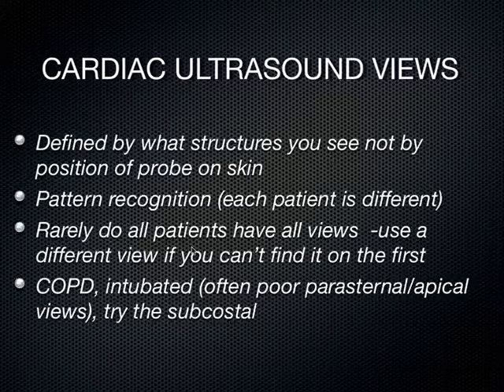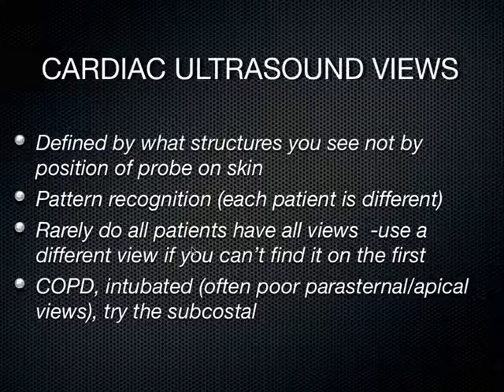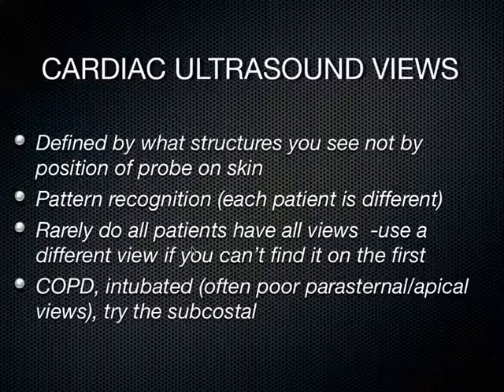And so remember that these cardiac views are really defined by the structures that you see on the screen, not necessarily by those areas I just pointed out to you on that last diagram. So this is where there's a lot of art. Everybody has a different shaped chest wall, and you really need to work to get these views in. A lot of this is pure pattern recognition. It requires probably the most amount of experience than any of the other things we're talking about to get all these views. And a lot of patients don't have all the views.